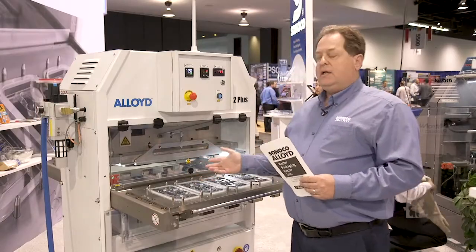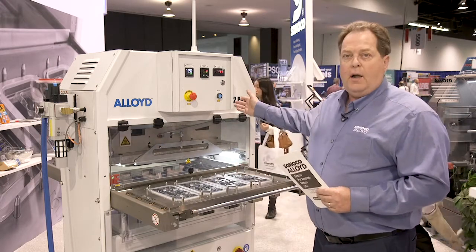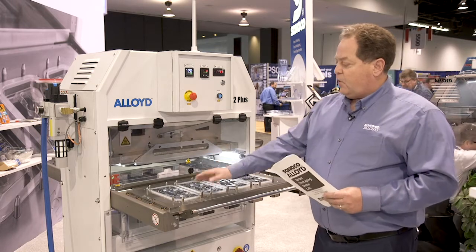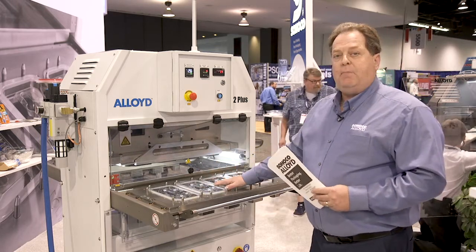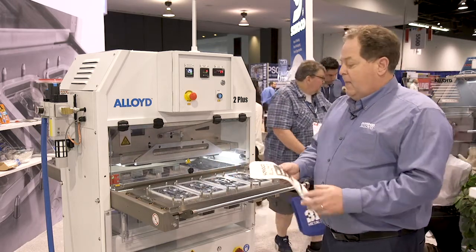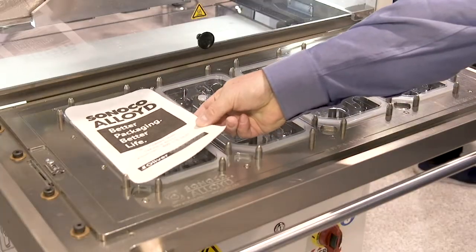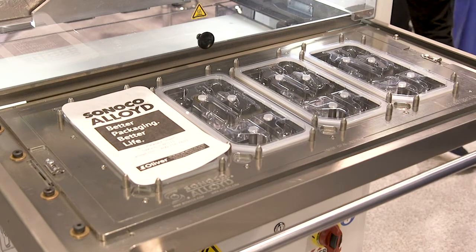Loading of the machine is all done in front or in the rear, so the machine can be set up with two operators. First trays go in, next would be product loading, and then the final step is adding the lidding material, which could be Tyvek, foil, or a clear type lidding material.